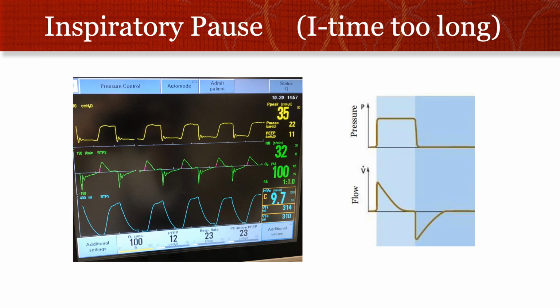This situation looks quite dangerous, however, because the pressure control above the PEEP is already 23, and the PEEP is 12. That high of a driving pressure with high PEEP is not a good situation. So it might be that everything's been tried in this patient, it's just not working, but I would be trying alternative strategies for this patient.